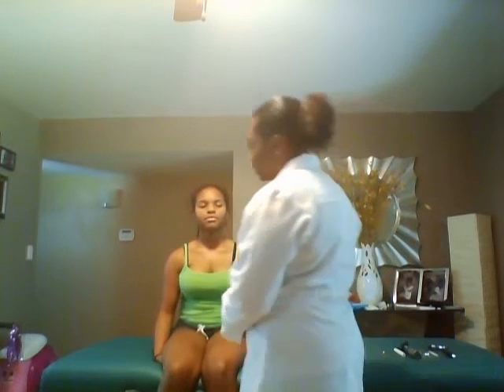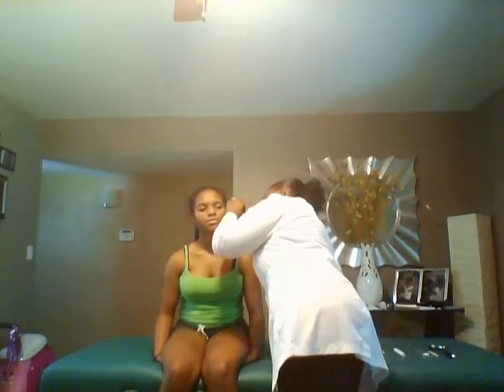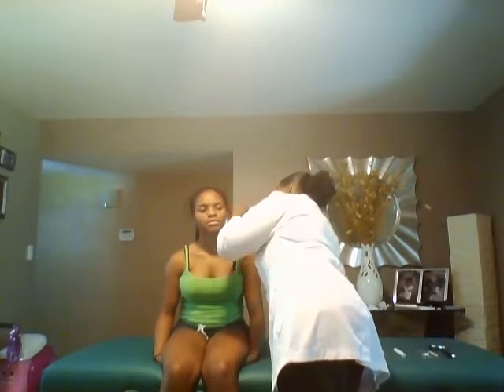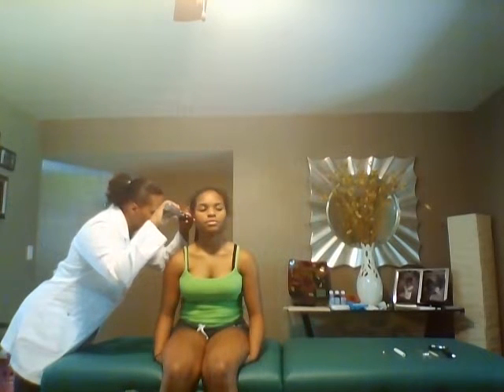Look at her external canals. There's no erythema or drainage noted. As I palpate her ears, there's no nodules. There's no pain or tenderness. And now I'm going to look in your ears at your tympanic membrane. As I look at her tympanic membrane, it is pearly gray, no erythema or drainage or fluid noted. Look at them on both sides. Her tympanic membrane is pearly gray, no drainage or erythema noted.